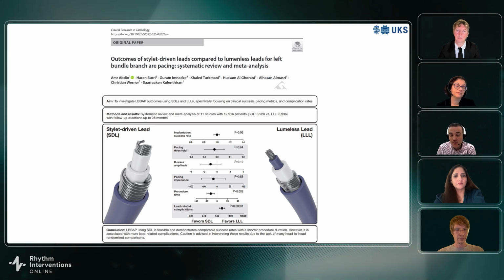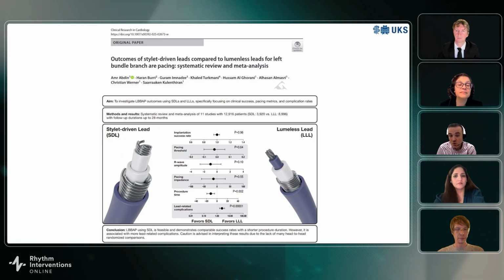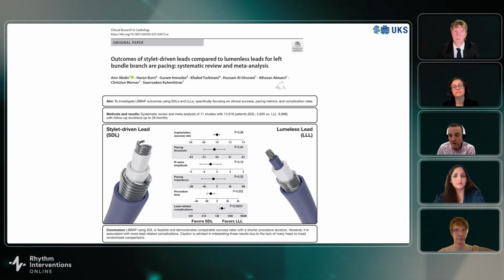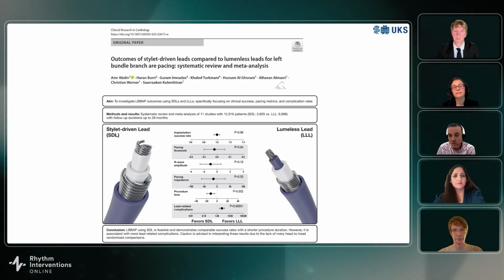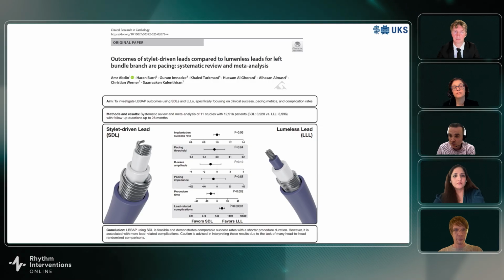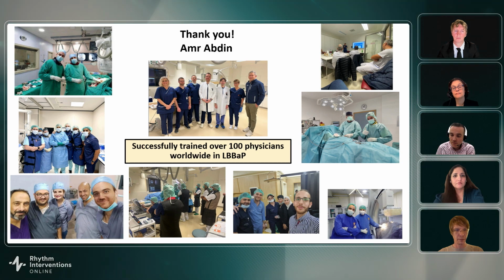And here we can see there was no difference in implantation success rate, also in pacing threshold, R wave amplitude, and pacing impedance. Procedure time was a little shorter using the stylet-driven lead. However, the rate of complications was higher in the stylet-driven lead group and lower in the lumenless lead group. We are talking about two main complications. The first one is fracture, and the second one is microdislodgement. I finished my second part. I'm happy to take your questions and all your comments.